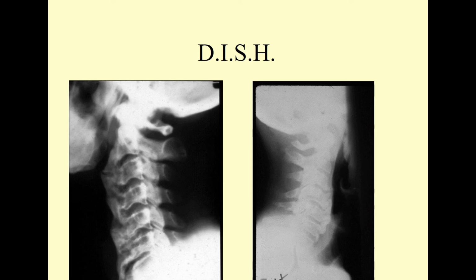So he got chemically twilighted. They put the camera in the mouth, pharynx, traced it through the esophagus all the way down into the stomach, and didn't see any problem. Well, you're only looking at the inside of a tube, and you don't notice if your instrument gets translated anterior, like they would have to get around the very thick ALL right at the uppermost portion of the esophagus.